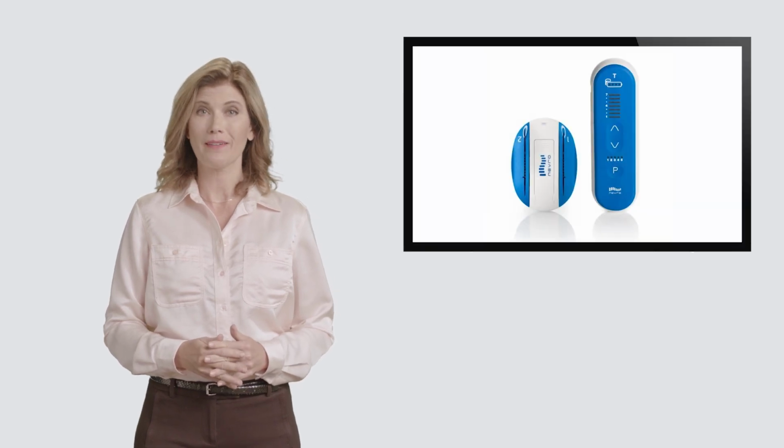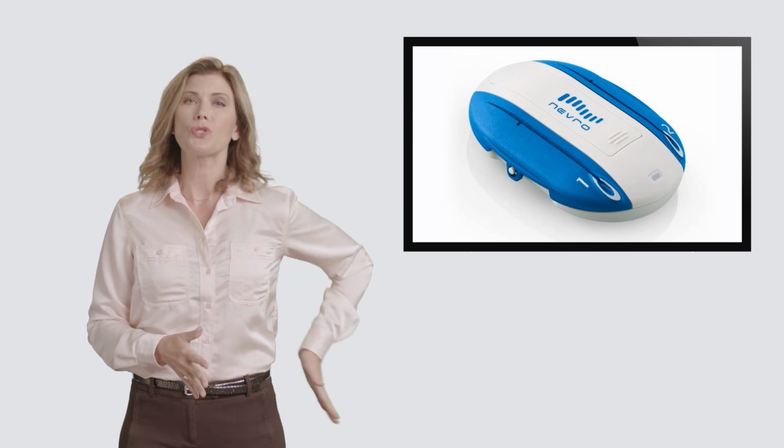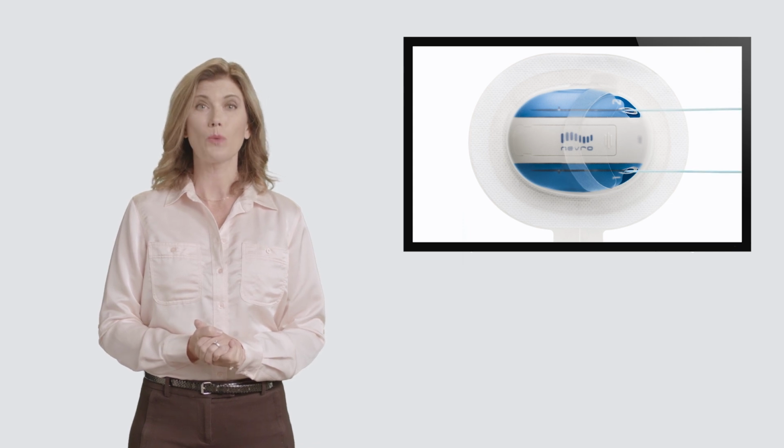Let's get started. During your Nevro trial, to evaluate your pain relief, you will be given a temporary stimulator battery pack and remote control. The temporary stimulator battery pack will be secured to your back. This battery pack is connected to leads that will deliver stimulation. The battery pack will be worn for the duration of the trial and is not to be removed without direction from your physician. You will use the remote control to turn your therapy on and off with guidance from your physician and Nevro care team.